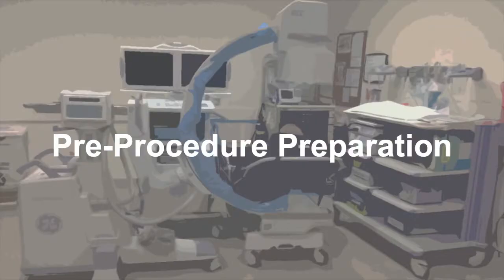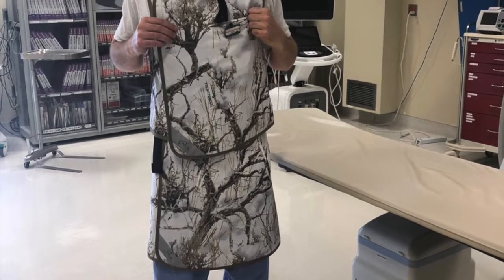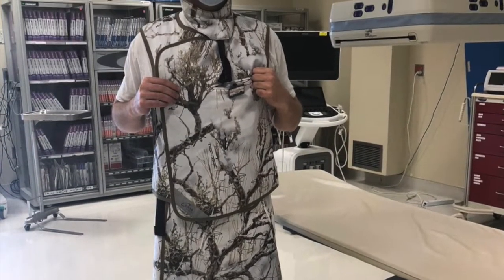Now that we are familiar with the C-arm, let's review important pre-procedure safety measures. Prior to starting the procedure, ensure that all staff is wearing protective equipment and a dosimeter.